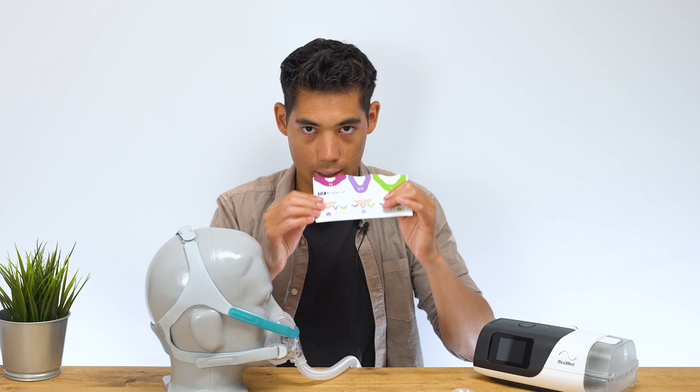Now let's break down the disassembly. To take off the tubing, don't just yank it — kind of break it apart like you're breaking bread. It's an oval shape so it doesn't go on just any way — make sure it's oriented correctly. Putting it back is similarly simple. To separate the mask from the cushion, hold down the plastic portion where the exhalation ports are and break it apart. It comes off like that, and you can see the exhalation ports on the side.